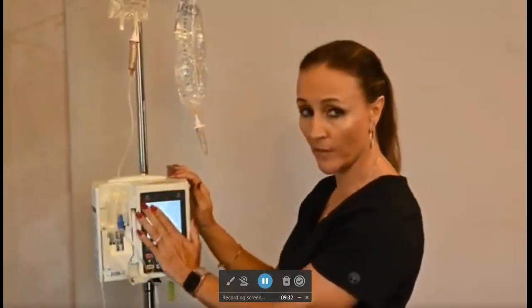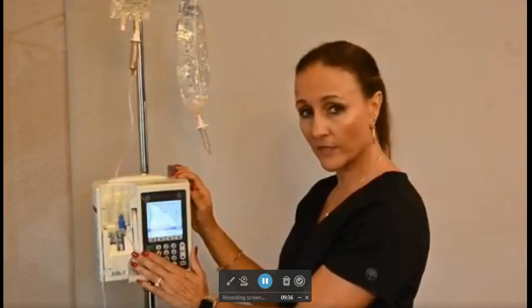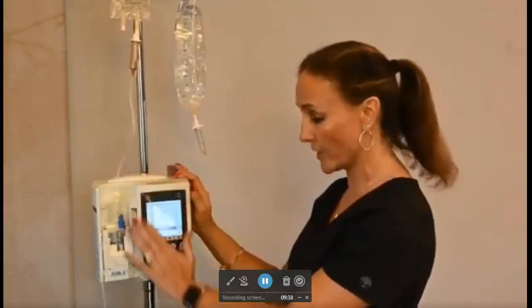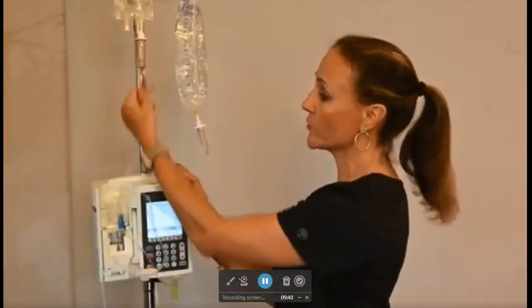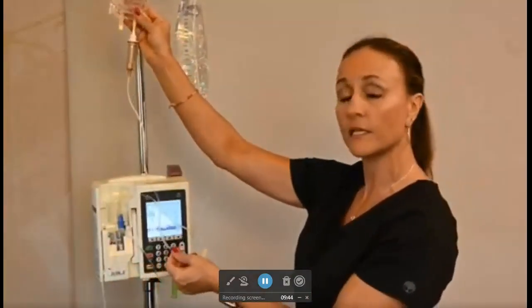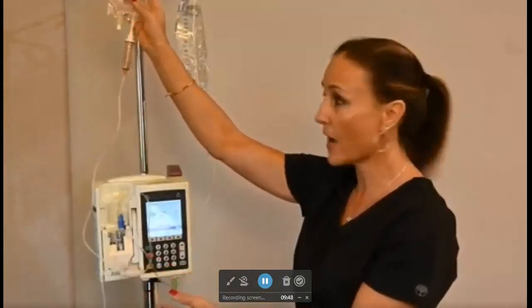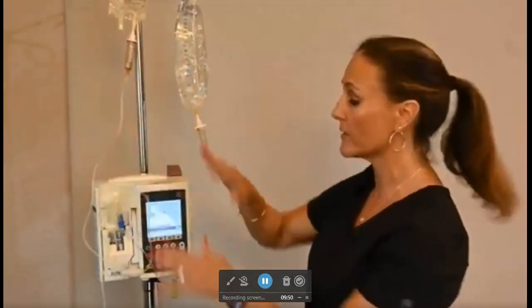This is something that you're going to do when you get into the skills lab. The nice thing about these pumps is that it knows the way that you program it, that this will run in over a certain amount of time. For example, if this is 50 mLs and I need to run this in 1 hour, then my rate would be at 50. So after an hour and it takes all of the antibiotic, the pump automatically switches and it goes back to the primary bag.